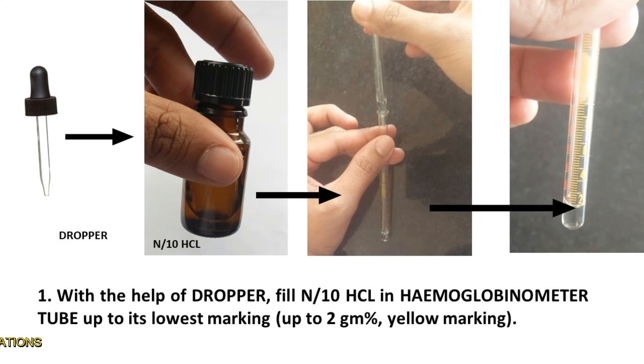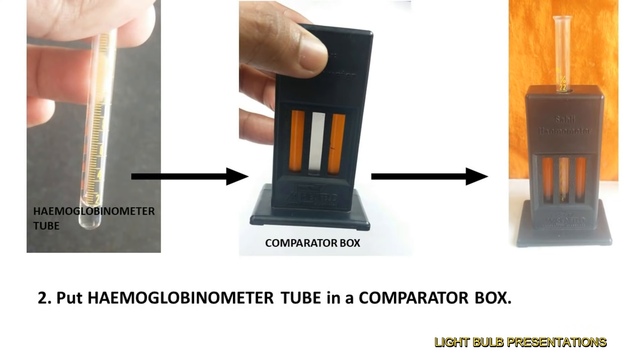Now we begin with the procedure. With the help of a dropper, fill N by 10 HCl in the hemoglobinometer tube up to its lowest marking, which means up to the 2 gram percentage yellow marking. Then put the hemoglobinometer tube in the comparator box.